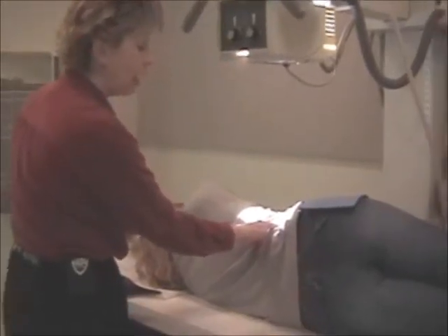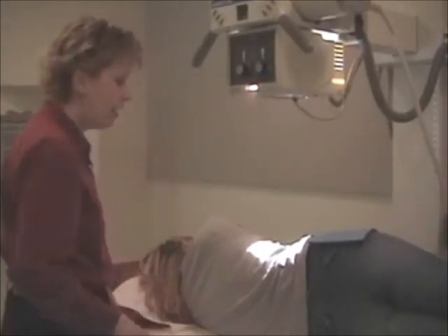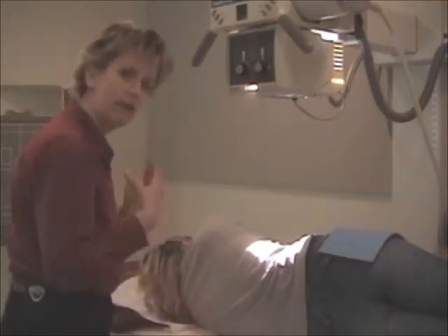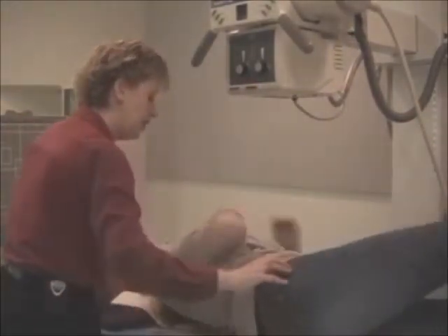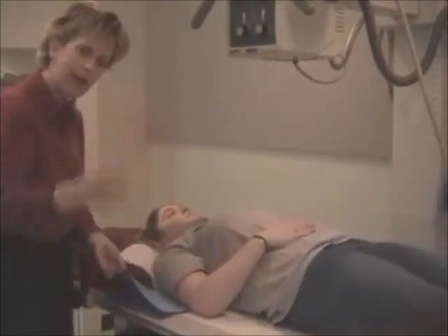And little tiny are your 80, 90-year-old pound little old men and little old ladies. That there's no muscle tone and everything shifts down. I've actually taken an x-ray of a stomach that was entirely in the pelvis. Because of muscle tone, everything just drops. Okay. Kristen, I'll have you turn on to your back. There you go. Notice we're having her go in one direction. I don't want her tipping back and forth.